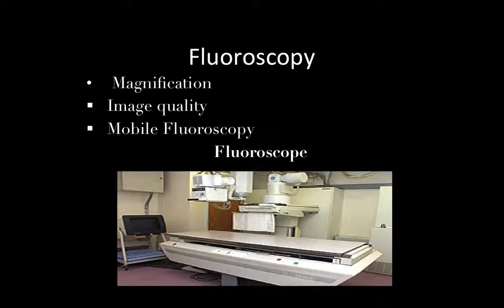Fluoroscopy also has to do with magnification, image quality, and mobile fluoroscopy. At the bottom of the screen you'll see a typical fluoroscope that's probably in one of your fluoro rooms at your department. Right under here is where the tube would be, the patient, and the image intensifier on top.